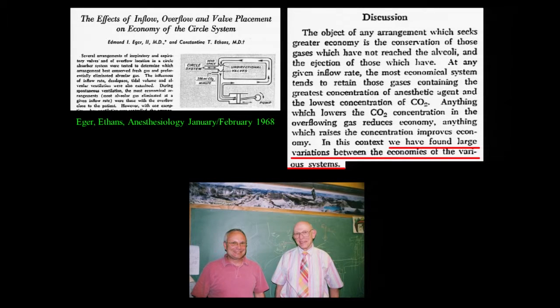And we know from Eger from many years ago that the manner in which these components are organized does have important effects on anesthetic agent. This is Michael Laster. It's veterinary doc for his animals. And this in the back here is a discussion we were having on the second gas effect as proposed by Phil Payton.